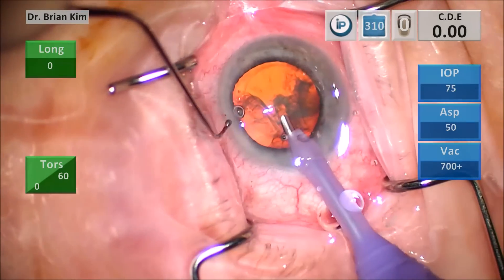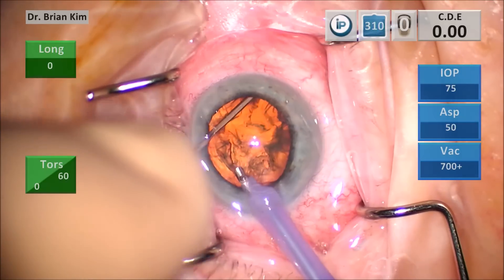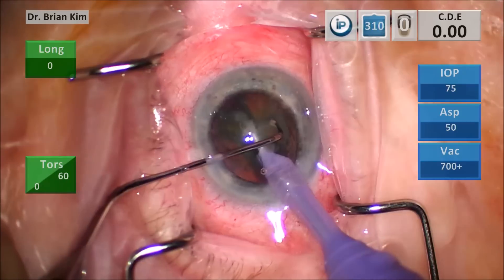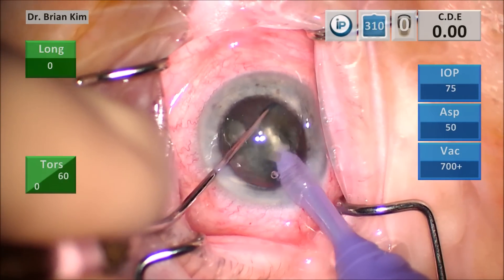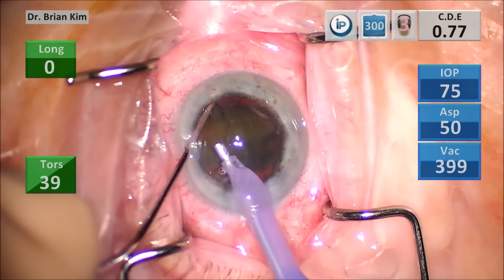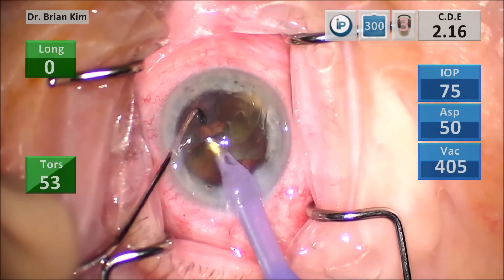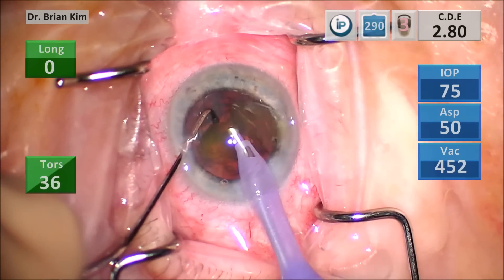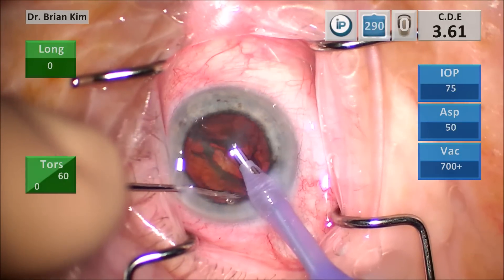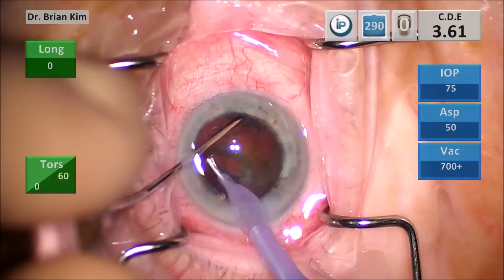This is another example. This is a large pupil but a little bit of a denser lens, one plus density. I'm going to drag the chopper out under the anterior capsule, FacoTip underneath, and draw the instruments together to chop the lens mechanically. This is all under irrigation alone — you'll see that the position is zero the whole time. I'm doing the cross-chop maneuver where I grab underneath the anterior capsule and chop the right hemi nucleus. At this point I'm emulsifying, but I only initiate ultrasound and vacuum when I am ready to remove the pieces from the eye. You saw that I had to go twice to make sure I was under the anterior capsule, and I always lead with the tip when I go around the equator.